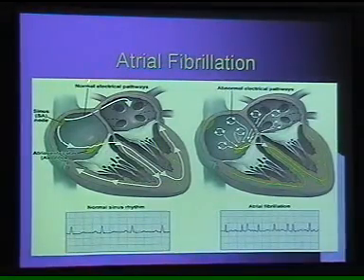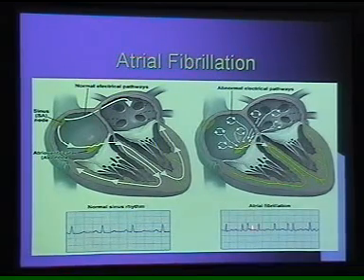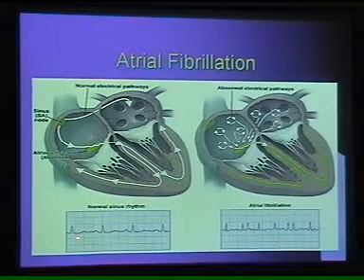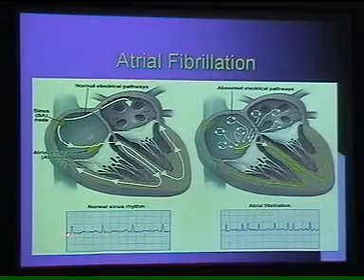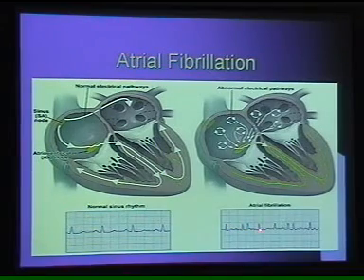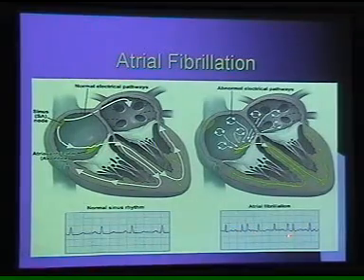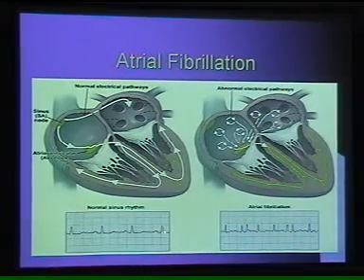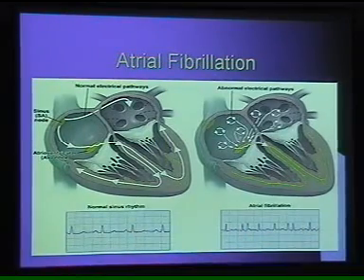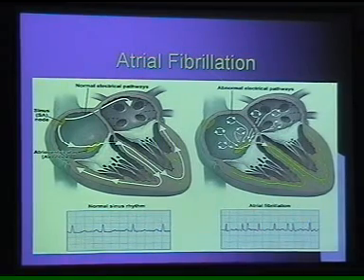Now, other important arrhythmias which we can detect from the ECG are the supraventricular arrhythmias, particularly atrial fibrillation. That's the normal sinus rhythm, regular RR waves, and here we find that the RR intervals are completely changing. Completely irregular RR intervals, and there is no P wave preceding any of these QRS complexes. So that's the typical appearance of atrial fibrillation.